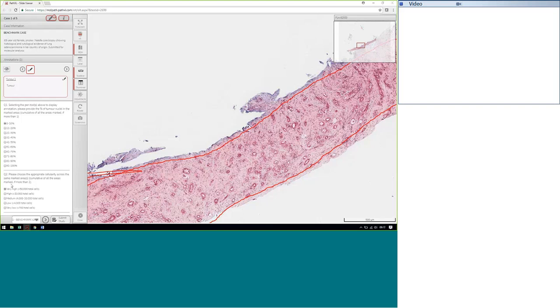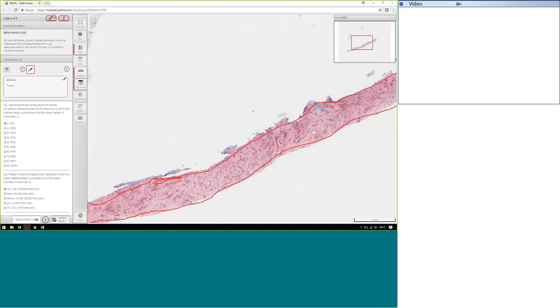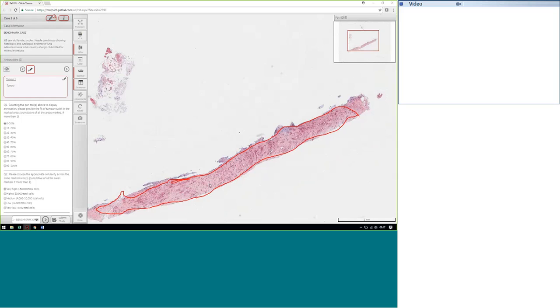determining the starting DNA for any downstream methodology, and the experts estimated the cellularity as low. This is typical of small biopsy material, where we have up to 5 micrometer sections available.